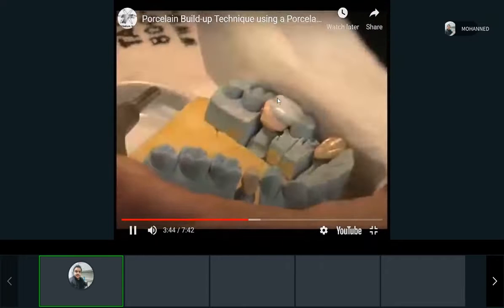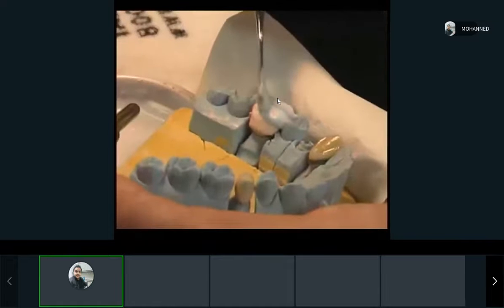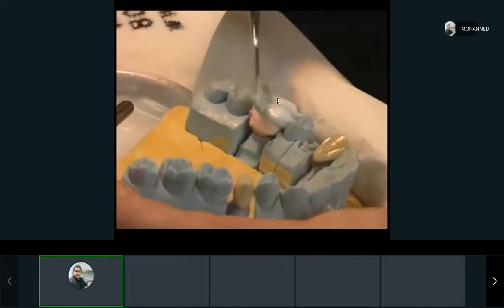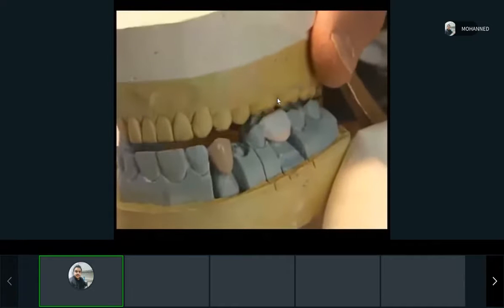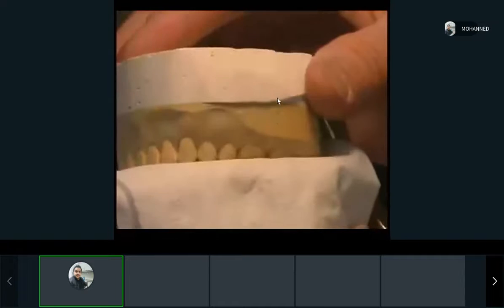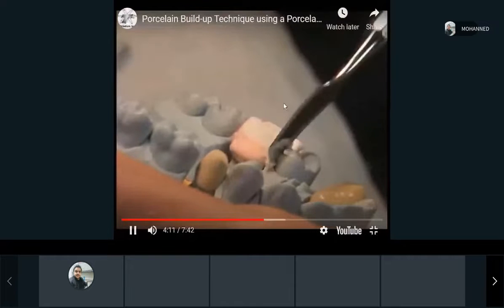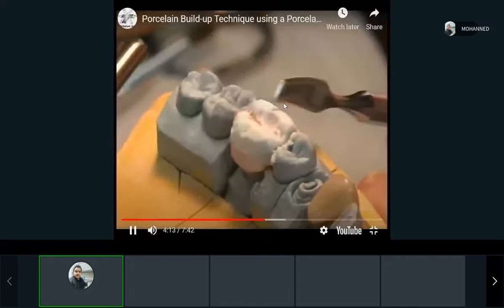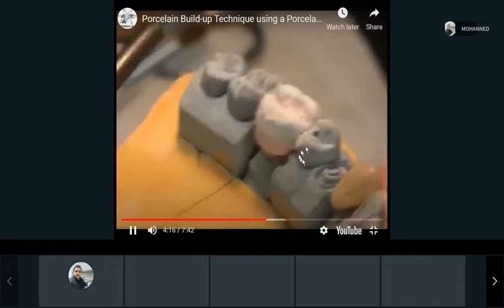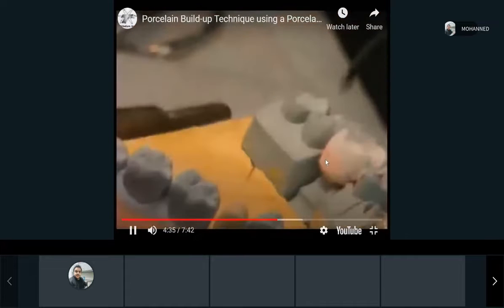Well, there are different layers that you put. You put first what we call an opaque layer, so you will not see the metal part of it. And then you put a body or dentin layer, technically, and then the last layer, which is a little bit more clear, just like the enamel layer. And you see that all work is done by the lab technician. They have to put all of the anatomy and all of that.